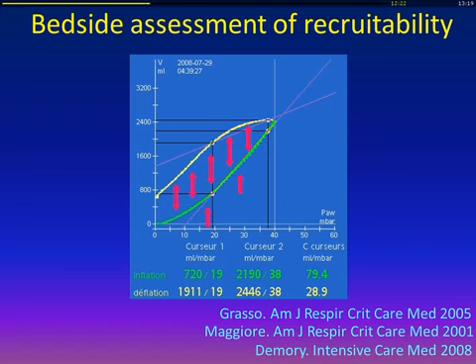So we can do it on the screen. We go to the PV tool, and we will set the PV tool. Okay, starting at a PEEP of 0, going up to 40 centimeters of water, going back to 0. Then, sorry, it's split it.